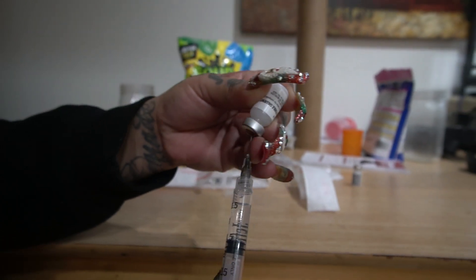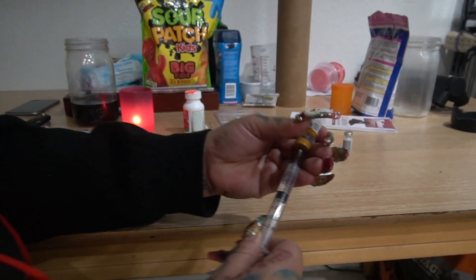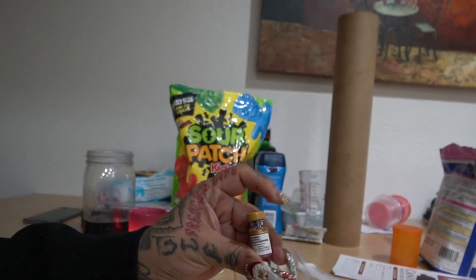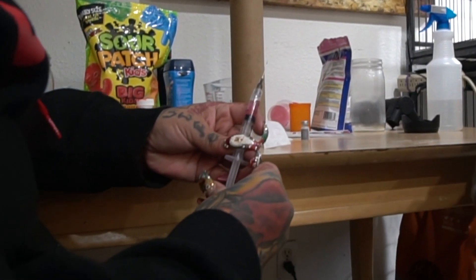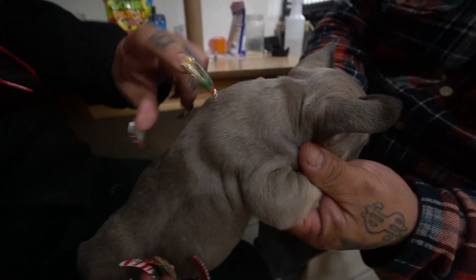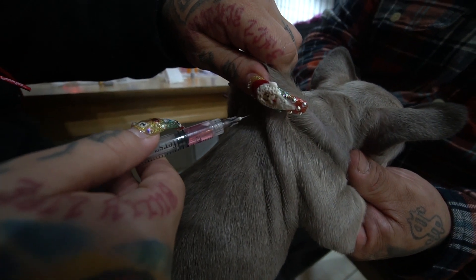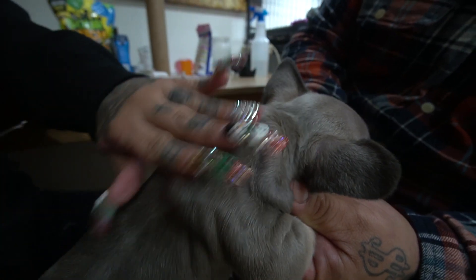Drain the liquid out, mix it. Once it turns pink, pop the liquid, drain it all forward — make sure there's no air pockets in the syringe — and it's ready to go. Grab the puppy in between the shoulder blades, lift up the skin, and stick it in there. And there you go.